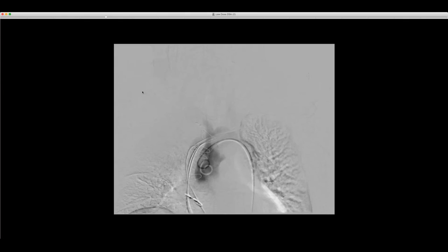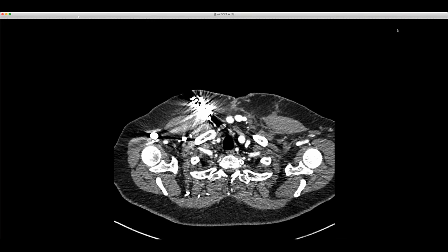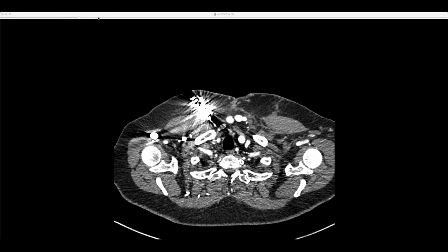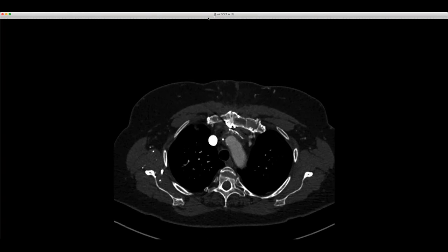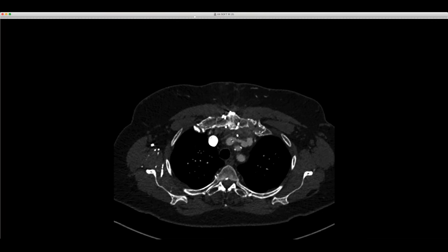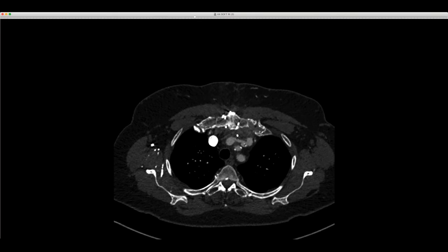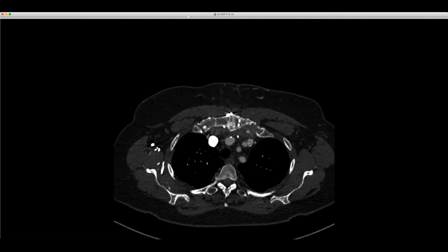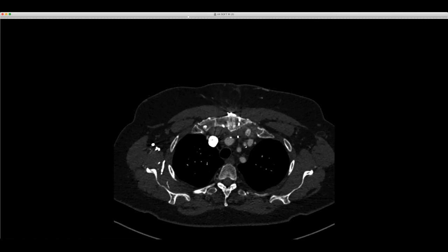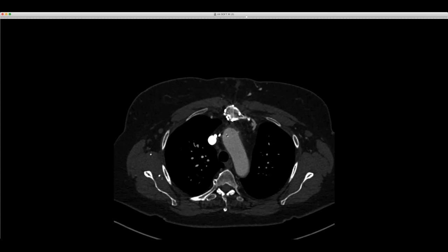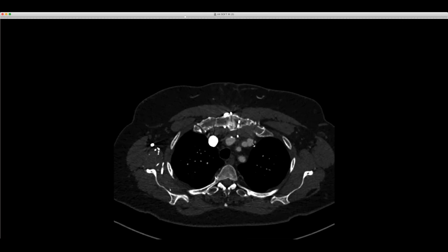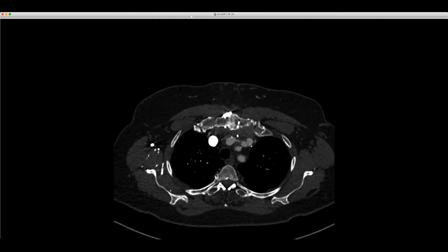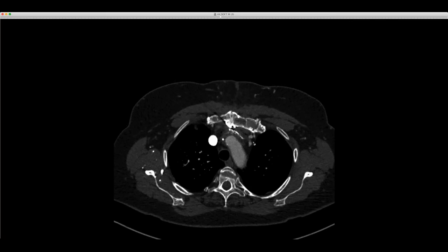So the aortogram was concerning for a fistula. We got a CTA. You can see that here's the fistula between the brachiocephalic artery and stretching across — it's about a four or five millimeter wide opening — to this really deformed-looking vein. So to the innominate vein. The rest of the innominate vein is stenotic, and you can see this irregularity of the vein, presumably due to damage from the lead revision and placement.